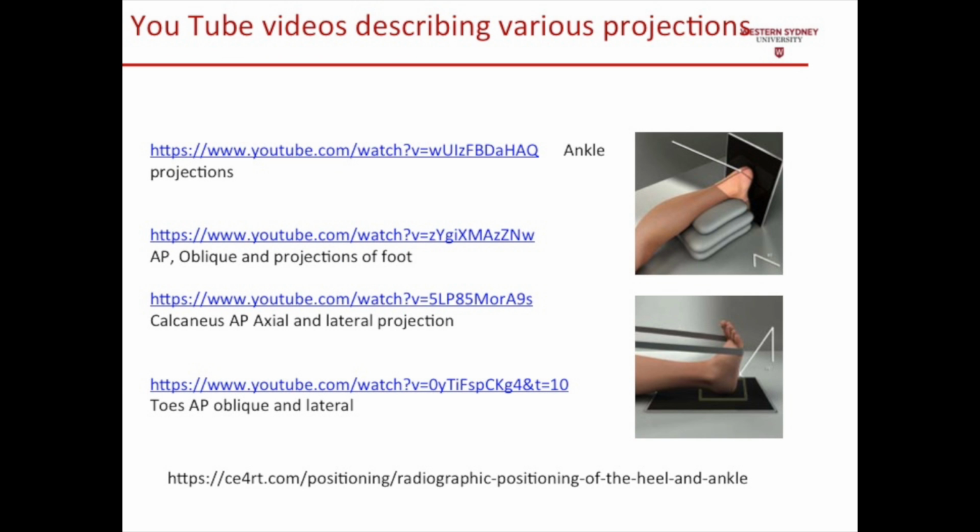In this lecture, I've taken time to simply go through the most common projections and views that you're likely to come across, but please take time to access these YouTube videos where you will find more information around various projections. There will also be some instances where it's appropriate to stress certain structures in order to assess the integrity, particularly of some of the foot ligaments.